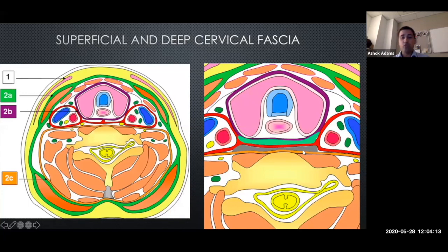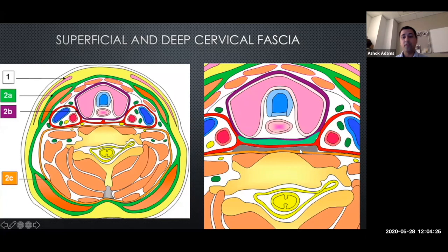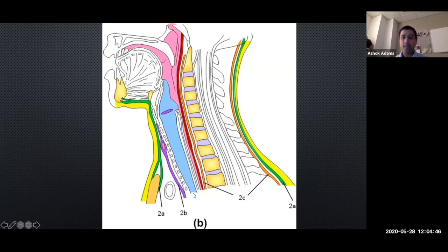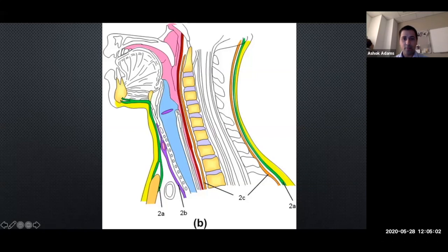The danger space is quite important if you're on call. Any infectious or inflammatory process can spread through into this danger space, which can then freely go down into the mediastinum. On the sagittal view you can see the superficial fascia enveloping the whole neck, the pre-tracheal middle layer enveloping the pharynx and larynx, and the retropharyngeal and danger spaces running all the way down, communicating freely into the upper mediastinum.